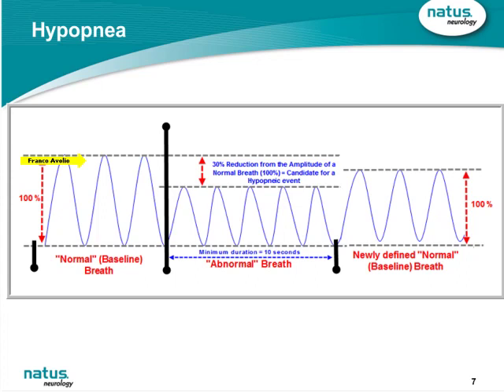If we were to try to average a new average amplitude, we would be including 3 seconds of normal breathing along with 10 seconds prior of apneic breathing, and that wouldn't necessarily give us an ideal average amplitude. And so it's not a moving window. The algorithm is a little more complicated than that, and it does go back a little further. Now, for the purposes of just demonstrating these reduction values that we're talking about, I put together this little diagram here.